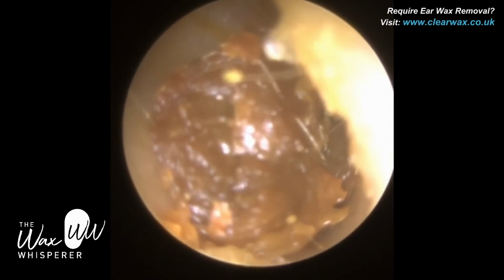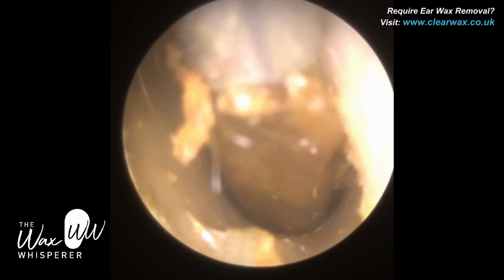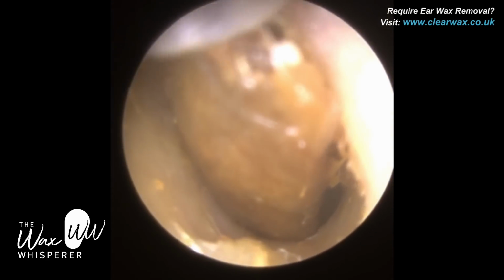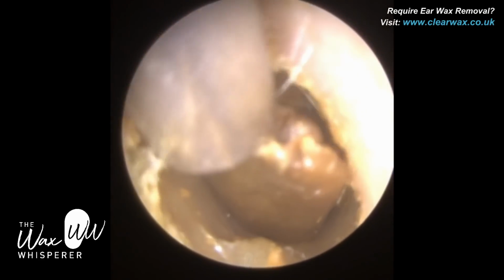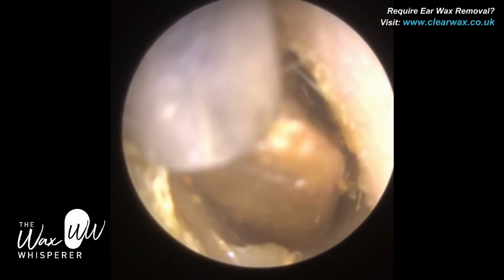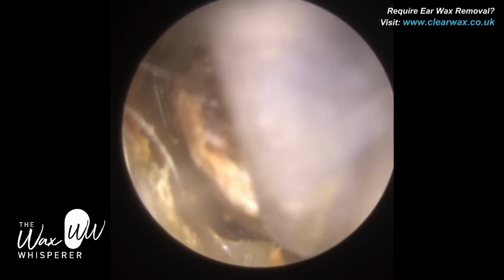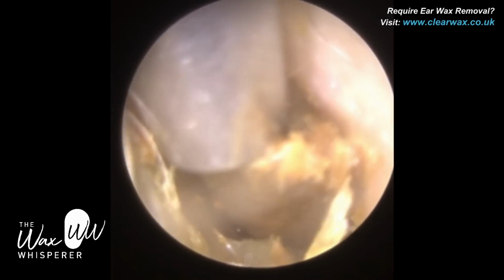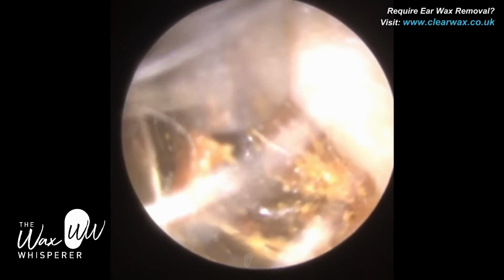And from there, the actual ear canal is virtually shut, so we have to really stretch it open. And this is what's great about endoscopic earwax removal. It doesn't matter how narrow or twisty the ears are. Once you've got the technique and the skill, you're able to navigate any ear, regardless of its anatomy or the age of the patient as well. So obviously children generally have smaller ear canals than their adult counterparts.